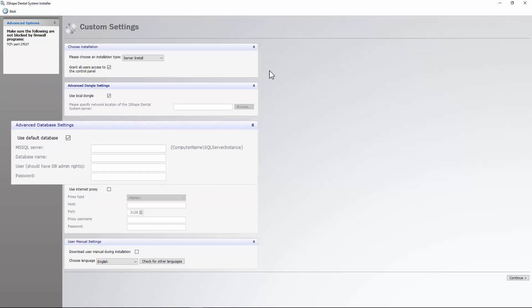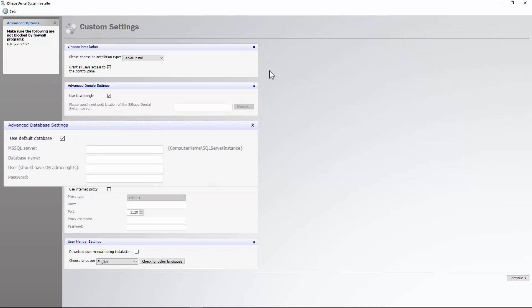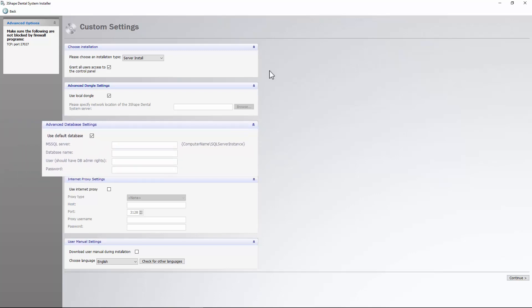With Dental System, it is possible for more servers to share the same database. In this case, you can specify the network path for the external database.